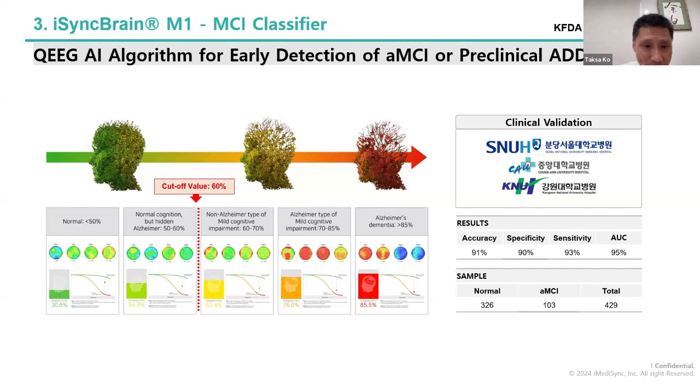It's a very acute opinion, I think. When I say this result is very strict, so many times, what sort of opinion should I have on the basis of these results? Every time I'm worrying about that.